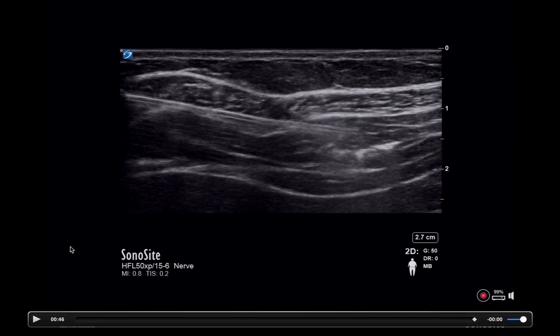And what we're looking for is that type of spread. We're looking for a spread so that the internal oblique peels upward and the transversus abdominis muscle peels downward, and by that I mean deeper. And if we can get a nice pocket of medication in between the two, we will have good coverage. Sometimes we don't see a great peel, even though we know we're in the right area. At that point, we need to move the needle, or progress it through that open layer, such that it peels a little bit more.